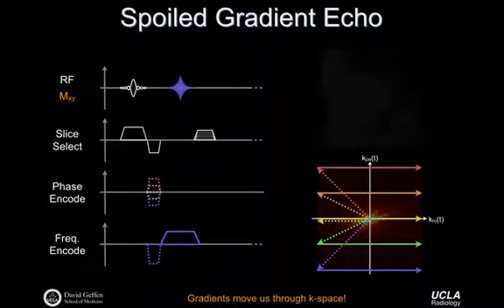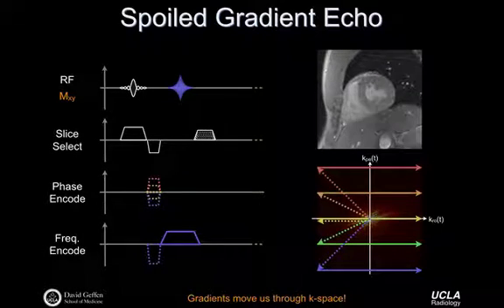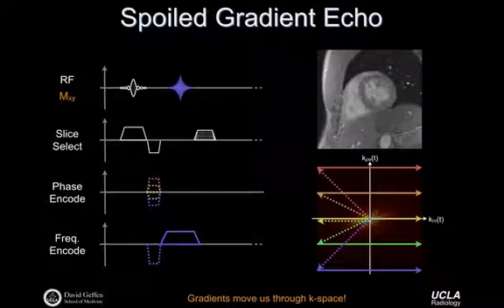Yep? Okay. End of the day, if you have all of your k-space data acquired, the 2D Fourier transform will give you some imaging data. In this case, we have, you know, maybe 15 different images during the cardiac cycle, so we have to rip through k-space 15 times to be able to build a movie like that. But that's a detail that we can touch on probably later.